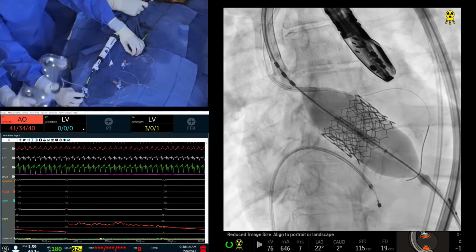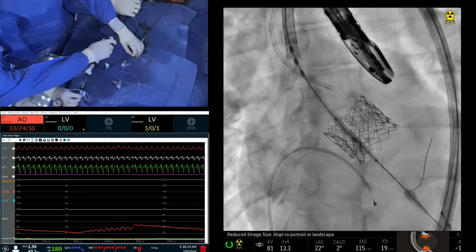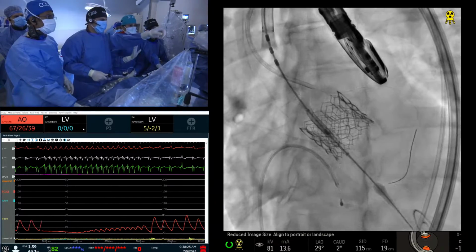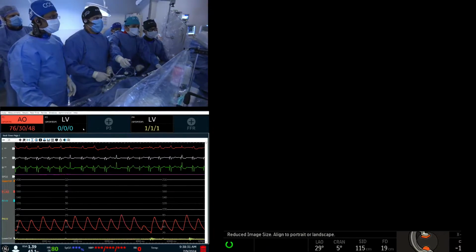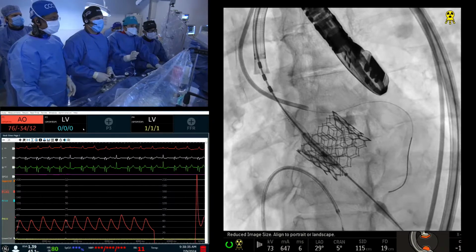All right, cine. We have to do double. Always fluoro. Okay, off pacer, off pacer. 80. Don't do anything. Pushing, pulling will create problems. Pressure is 80. Yeah, the pressure is good. Just do an angiogram. I don't think you need it. With the balloon there, you won't see much. The LVOT looks pretty nice. Oh, we have a little bit there.